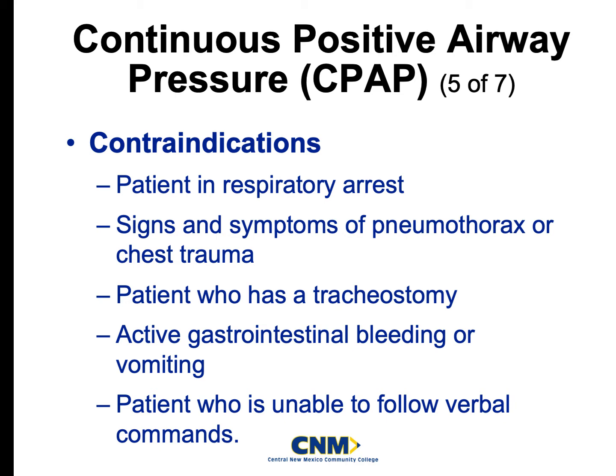And guys, yes, it can hurt you, but this is a very non-invasive machine. If you ever get the chance with your services to actually put one of these on, do it. Take some nice deep breaths in, okay? I guarantee they will be the best breaths you have ever taken in your life.